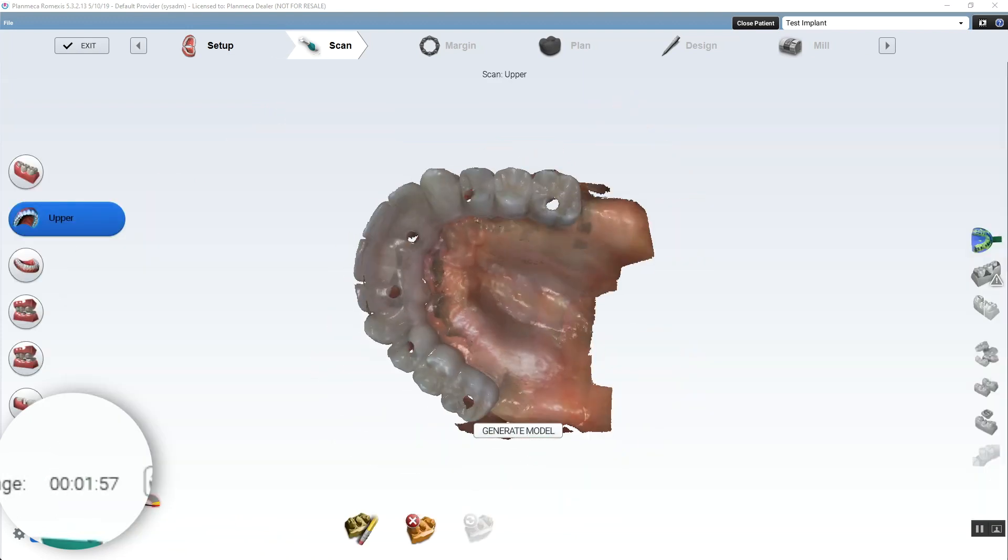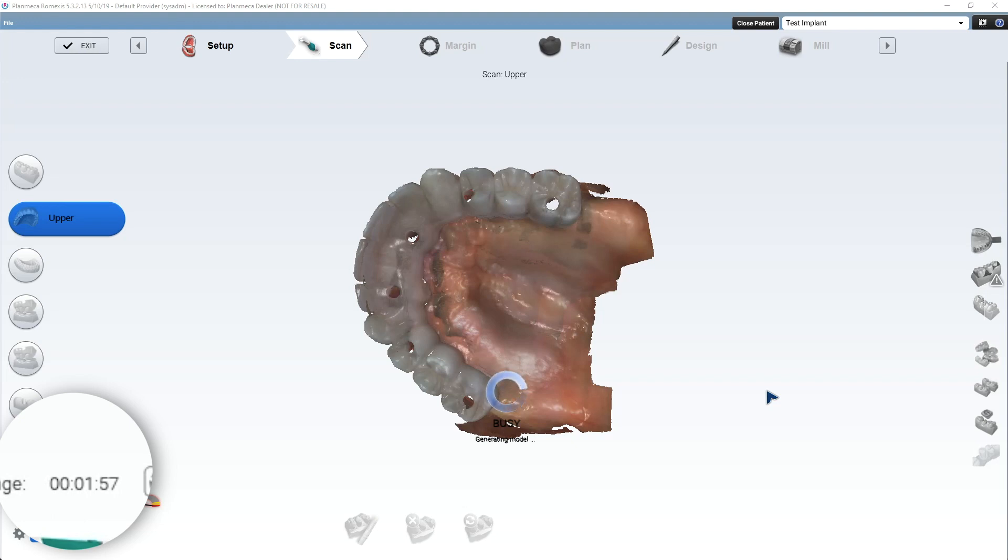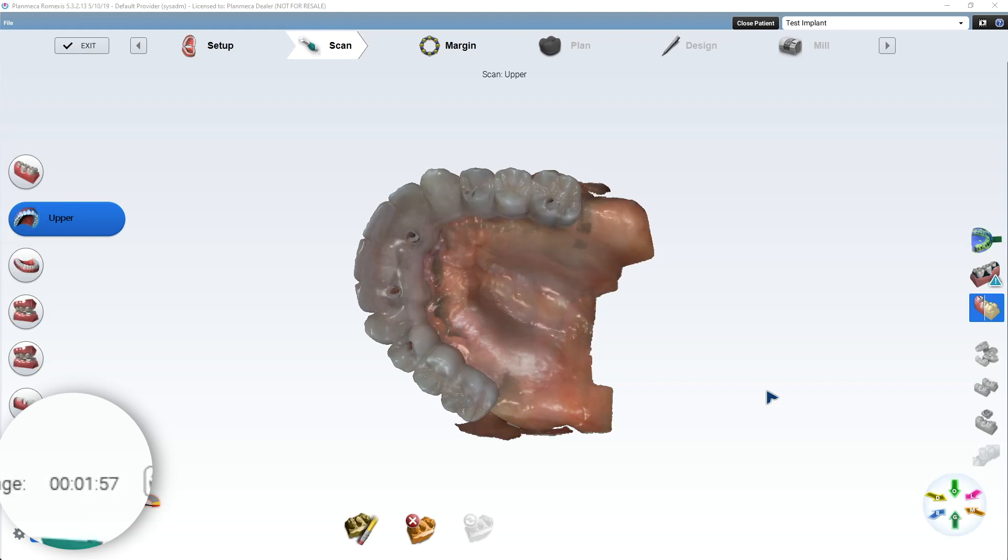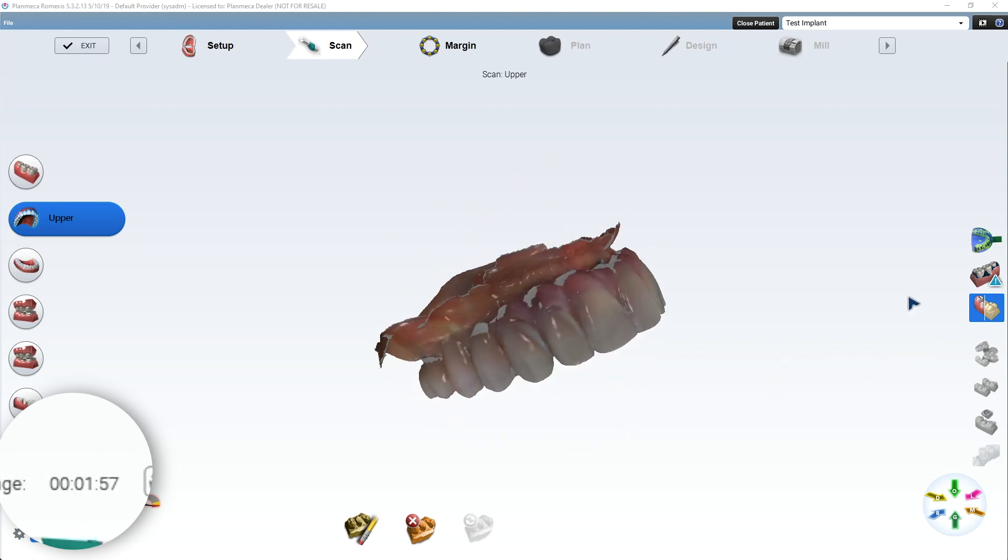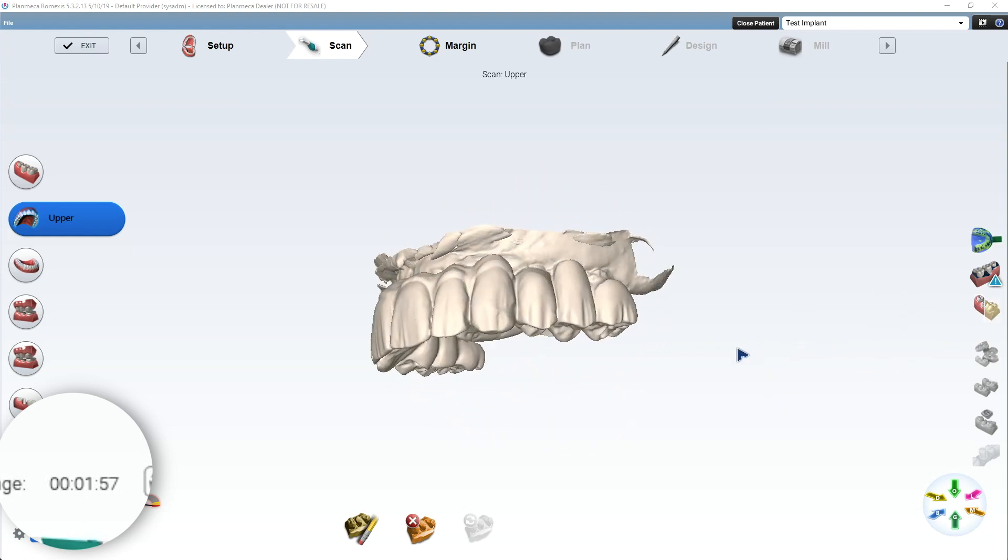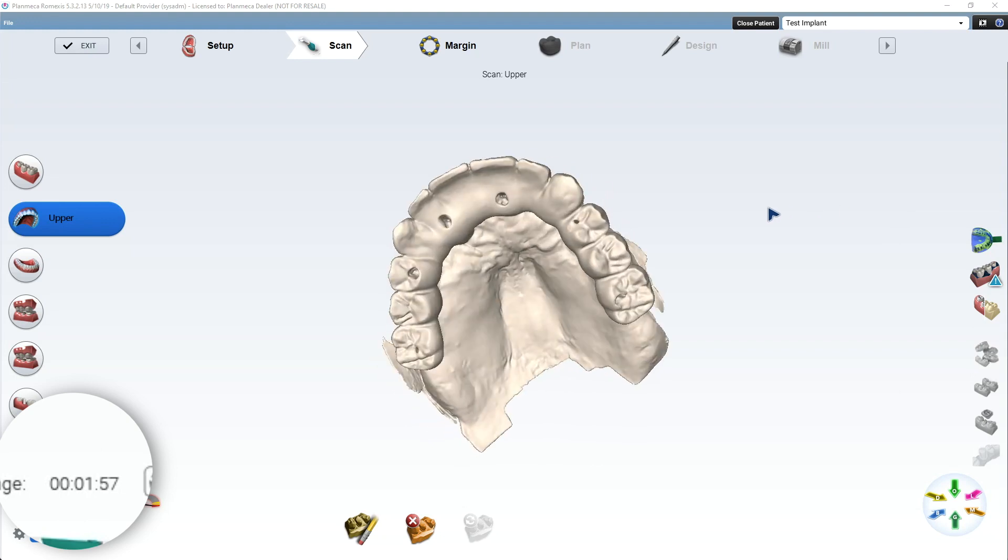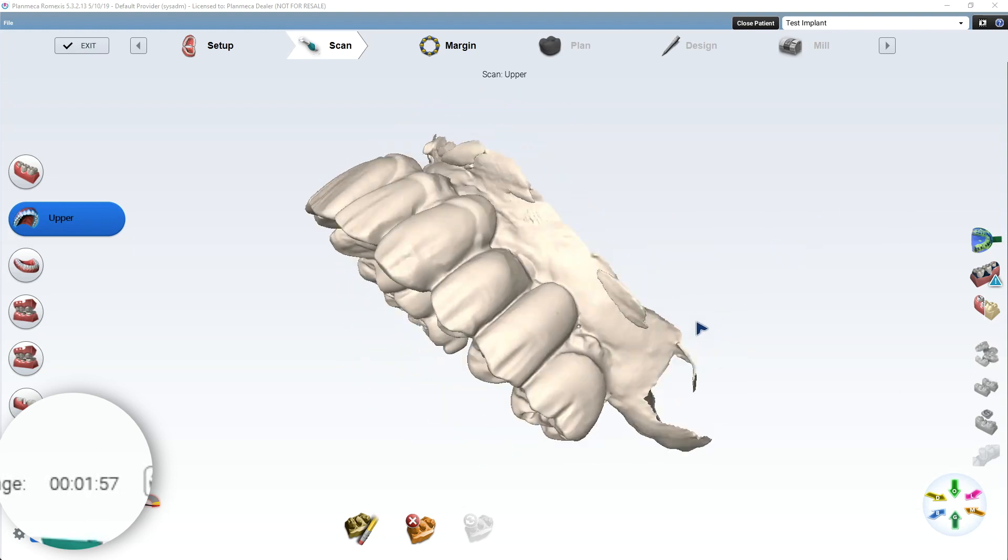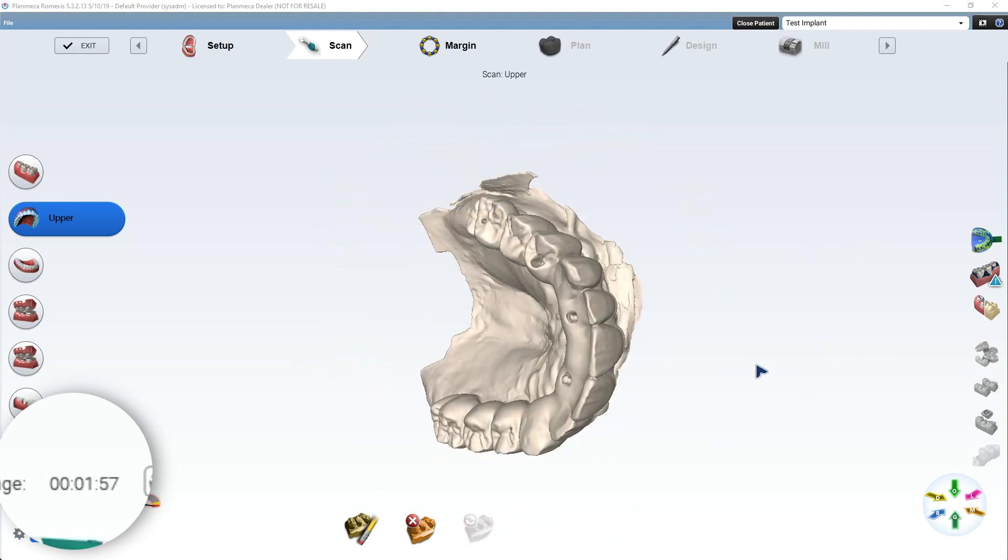Let's go ahead and render the model, and I think that's going to also be in real time, so it's going to be a little bit painful. A large scan like this takes some time to render, but it's still, I think, the fastest render time out of any system on the market that I've played with. So it's important to capture the soft tissues of the palate and as far back as you could comfortably go, and a little bit on the facial soft tissue. So here's this stone view. You can see how nice and detailed that is. There's no stitching errors or alignment issues.